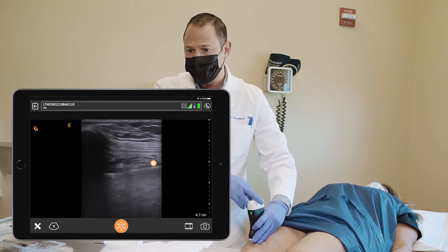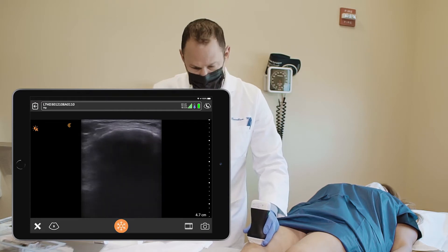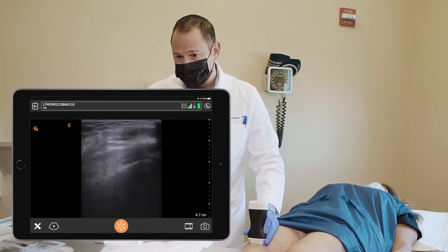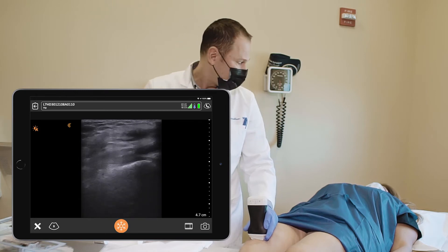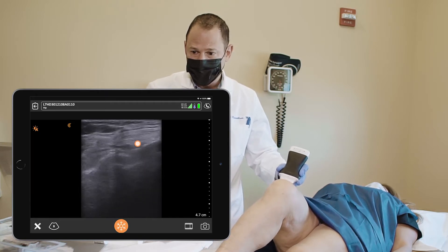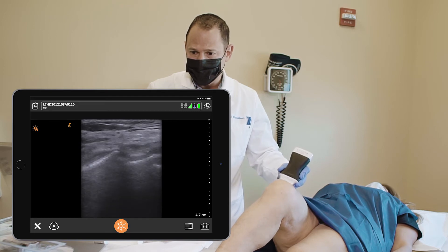I'm going to turn my ultrasound probe 90 degrees. Suprapatellar scanning now. Can you bend your knee 90 degrees, Rosie? Bending the knee will expose the suprapatellar recess, as you can see here. And that will be the target for this injection.